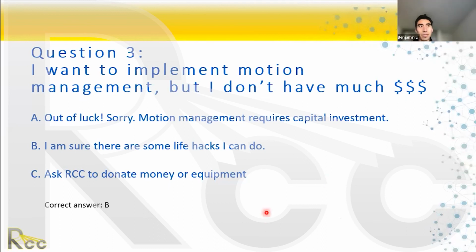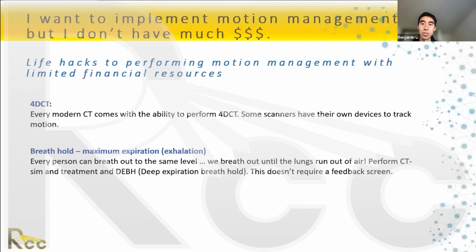Yeah, it's important. You want to try to have them the same on the day of CT simulation as they're going to be on every day of their treatment. So are you going to give them Xanax every single day of their treatment? Maybe, but more likely you can talk to the patient and try to make them feel more relaxed, understand what it's going to be, and then they feel more comfortable, because once they get to their last treatments, they're probably going to already be more relaxed and comfortable. So you want to make them feel that way from the very beginning.